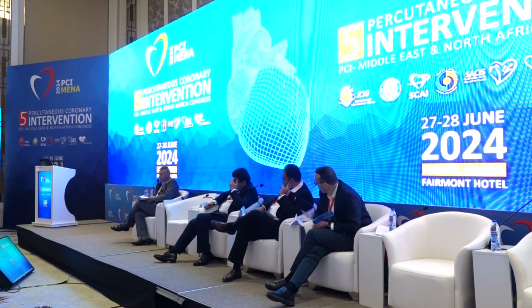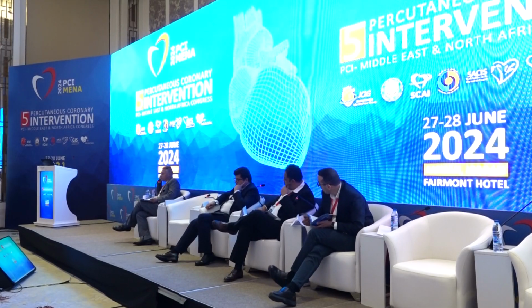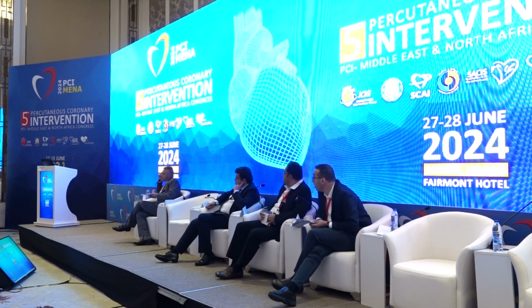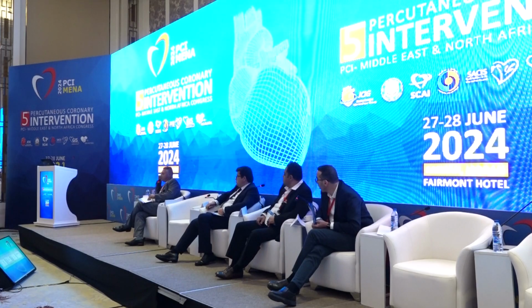And my comment to Dr. Ahmad is, the balloon pump, we probably should have used it in the beginning of the case, and always the RCA makes a big difference when we deal with left main disease. And I know we have students and fellows here. You know, the line doesn't end with us. If a surgeon says he's too high risk and he is so complicated, I know this is an interventional conference, but there is something called medical therapy. We can't just go into every artery, and sometimes we leave the patients with worse complications than we start with.